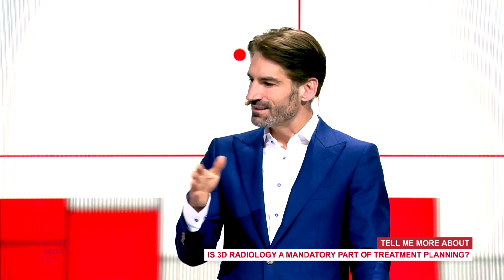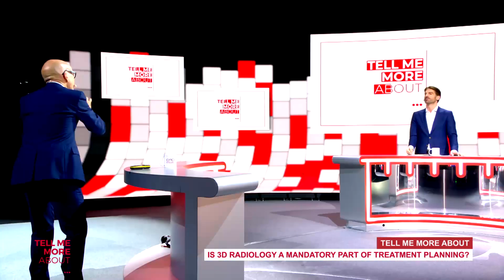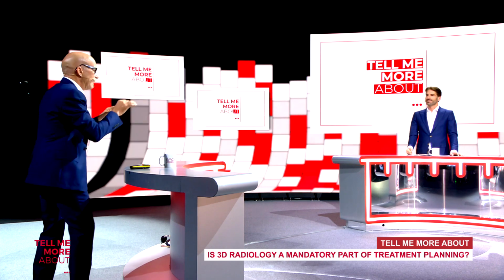Is it for you then like a pilot, so to speak? Yes. Is it the back and forth between the monitor and the patient? I go back and forth. And you validate whether that is still correct? I go to the monitor, I check there, then I go back. Is it really there where I am according to my planning? And this helps me a lot, specifically when I try to go as close as possible to the nerve.